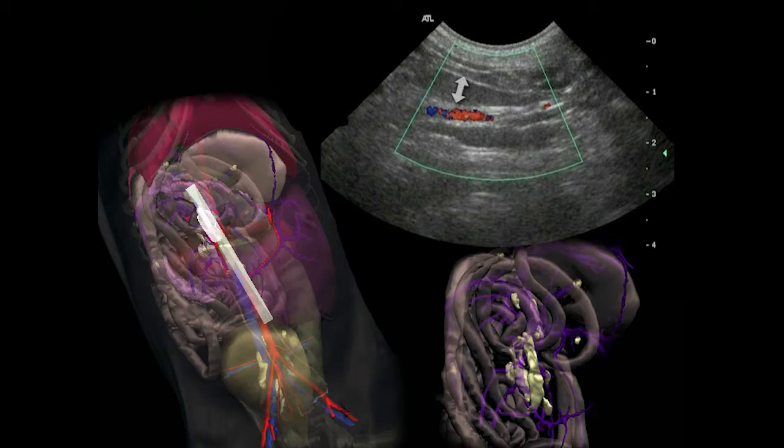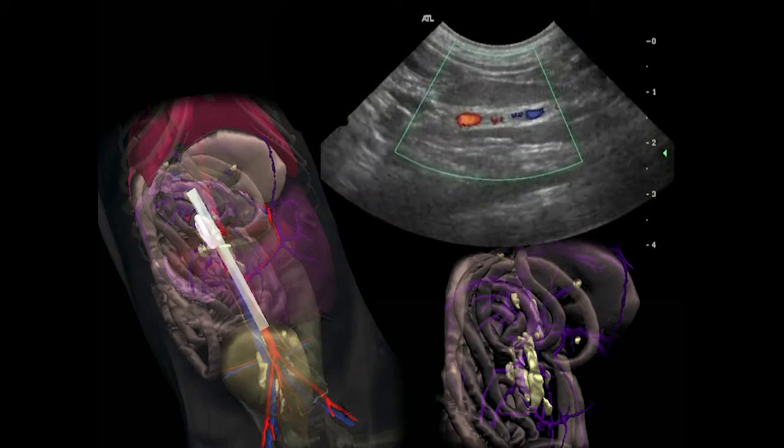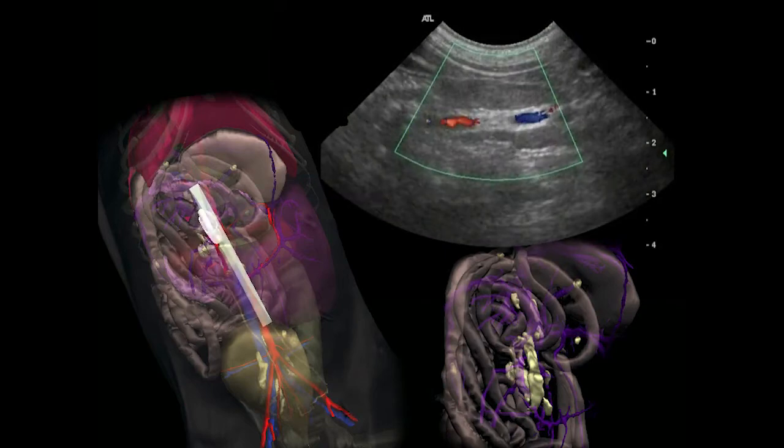In terms of thickness, the nodes can reach approximately 3 to 4 mm in cats and up to 8 to 9 mm in large breed dogs. Remember that they are often more prominent in young dogs. Observe the pulsations of the cranial mesenteric artery that enable us to confirm the presence of the adjacent lymph nodes.